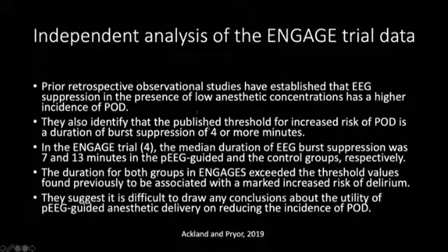They also identified that the published threshold for an increased risk in postoperative delirium is a duration of burst suppression of 4 minutes or more. And I want to remind you that in the ENGAGES trial, the burst suppression was 7 and 13 minutes between the two groups. And they're saying that prior data says that if you're longer than 4, you're at risk for having POD. So again, it calls into question the interpretation of the ENGAGES trial data offered by the authors of that trial.